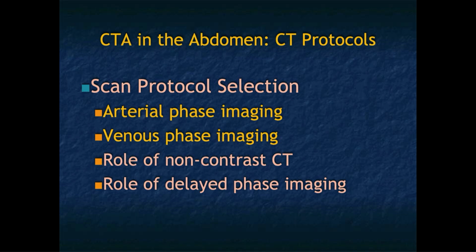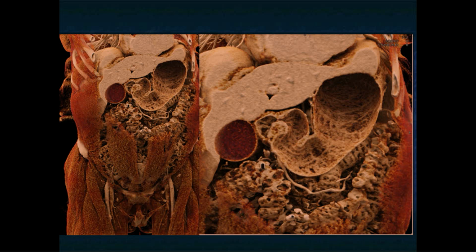We're doing about a 30-second delay on the arterial phase, injecting 5 cc's a second, and doing about a 70-second delay on the venous phase. And as I mentioned, we do not do non-contrast. We do not do delayed phase.